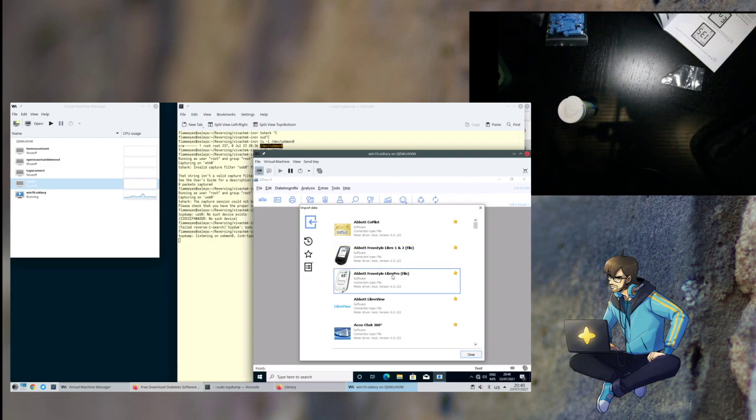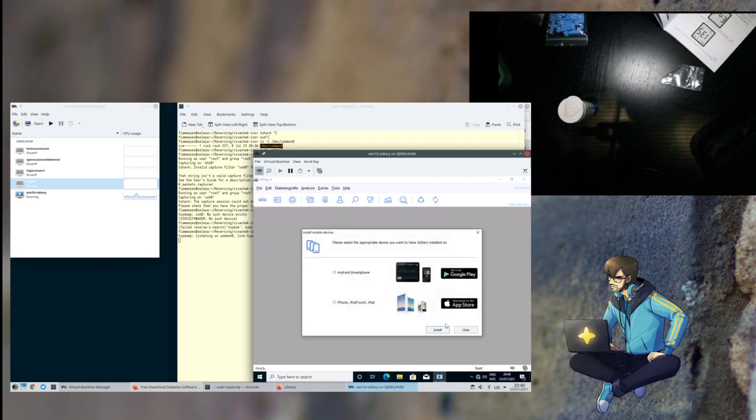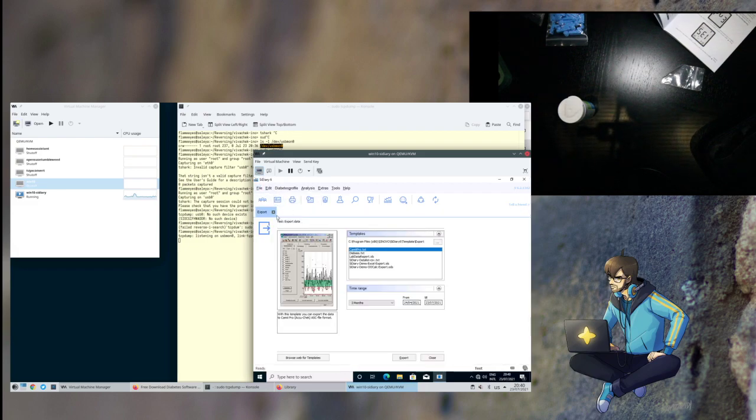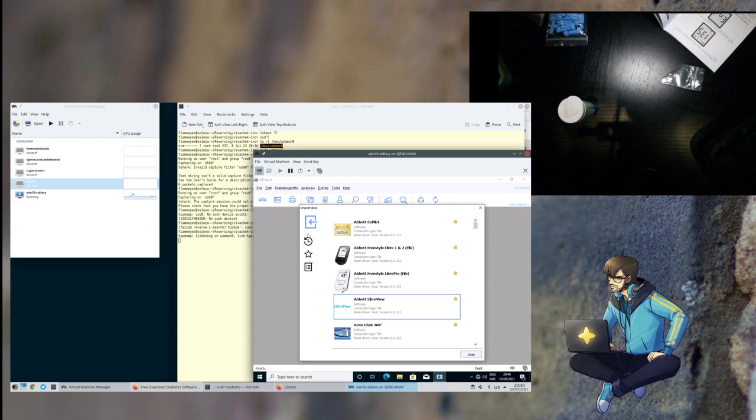So, funny thing, this has the Abbott Libre 1 and 2 as a file with the ASCII driver. It's interesting, it doesn't seem to have a driver for what I'm looking at. Yeah, that's the mobile devices. No, I don't want those. Let's export data. I have a feeling that it may be that the drivers it cannot initialize. I don't have any device.